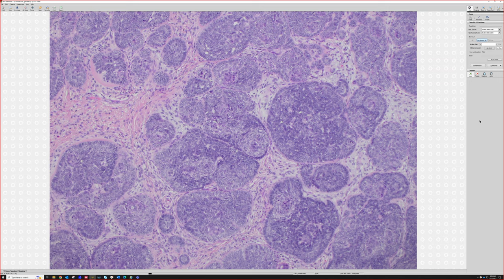Unless it's frankly cytologically malignant, like nasty, ugly-looking high-grade cells, then I'm going to be really worried about it. But otherwise, I don't find looking at the cytology or counting mitoses to be very helpful to discriminate basal cell carcinoma from trichoblastic tumors. Sometimes you can do CK20 and see scattered benign Merkel cells, which tend to be present in more abundance in benign basaloid hair follicle tumors like trichoep and trichoblastoma, and tend to be minimal or absent in basal cell carcinomas.